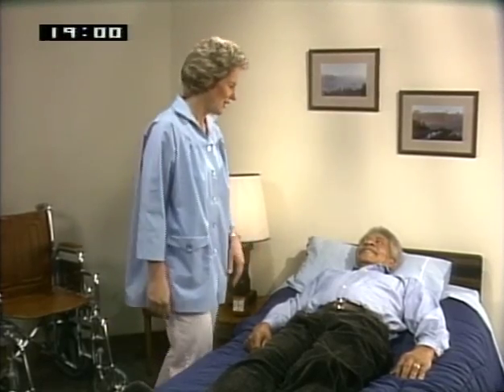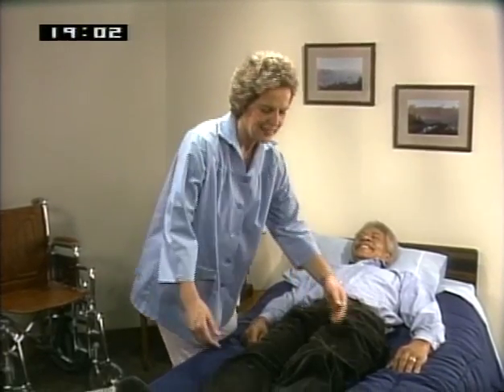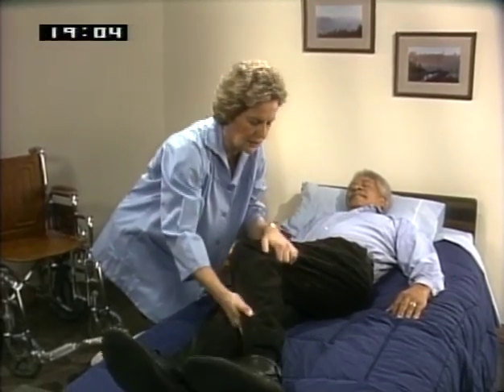If the patient has an adjustable bed, it would be most efficient to raise the head of the bed until the patient is sitting up. You would then simply slide his legs over the edge. Tom and Judy will use another approach that works well. Help the patient turn on his side facing you by flexing his knees and rolling him towards you.